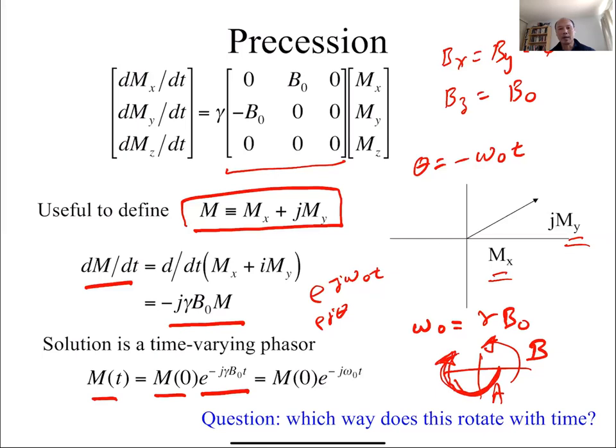That's important to keep in mind as we get more and more into MR: to have a sense of which way the phasors are going. Are they going this way or that way? And if you forget, you can always go back to this picture and ask, what's the phase at this point in time?